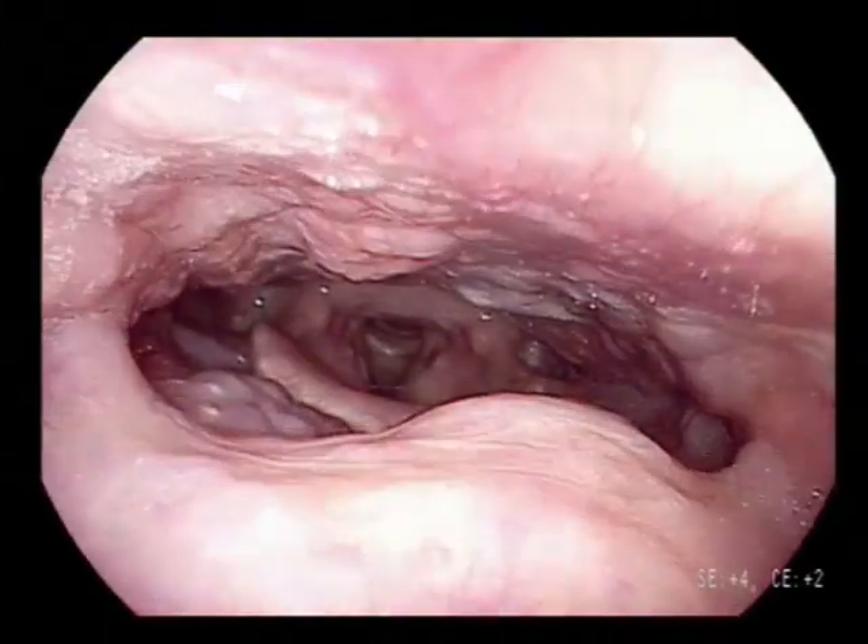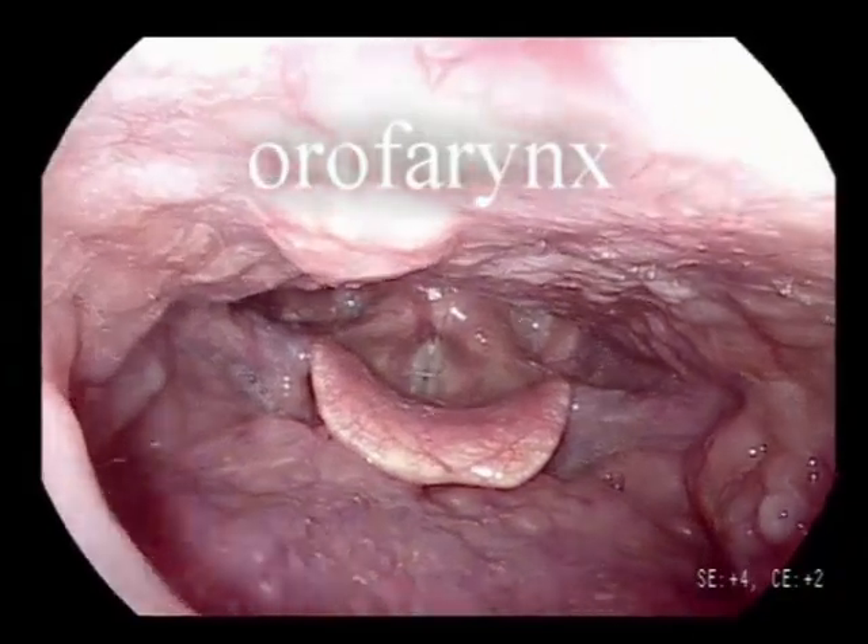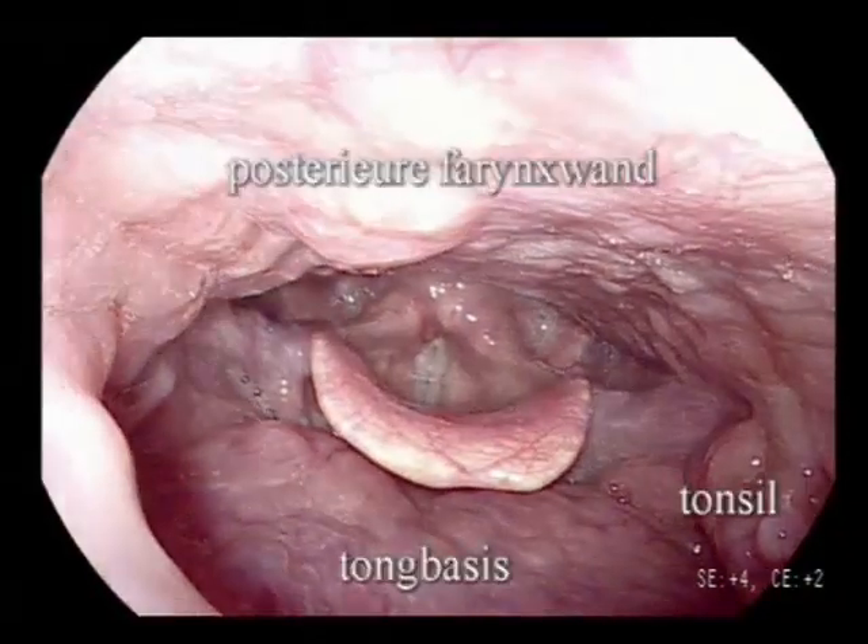The larynx is examined in four stages: namely the palatum, base of the tongue, glottis, and pyriform sinus. Pharyngeal musculature can be tested by letting the patient make an increasing tone.